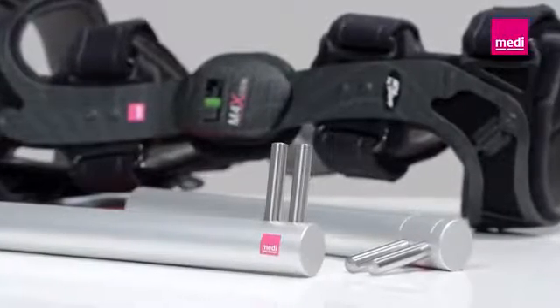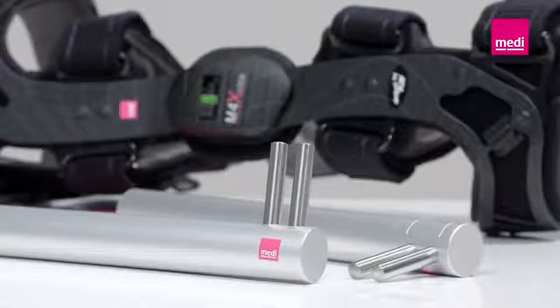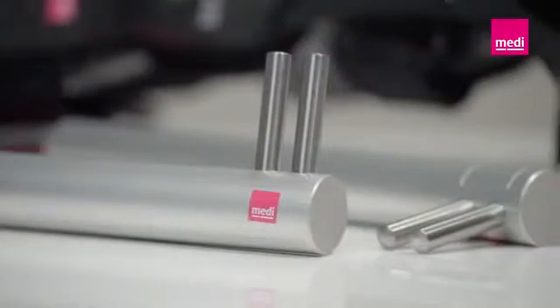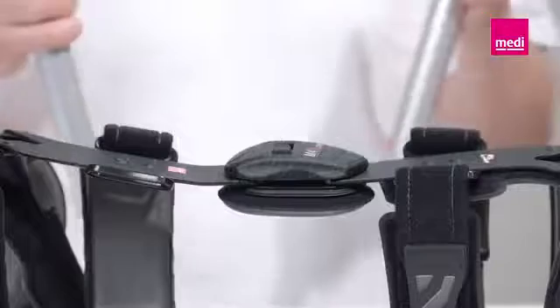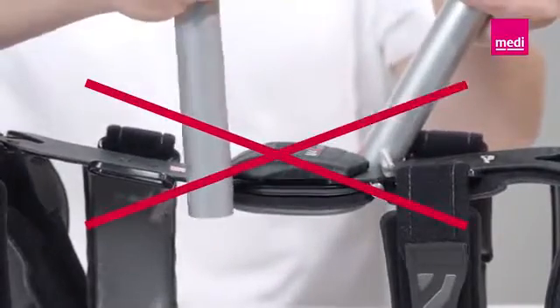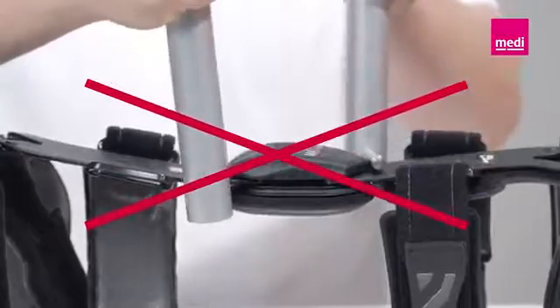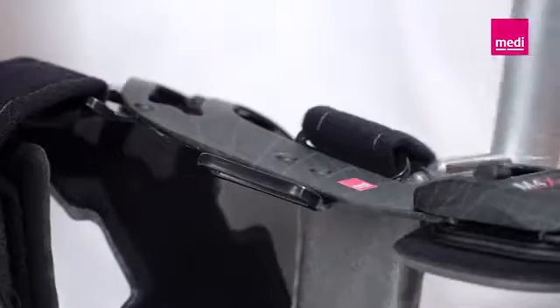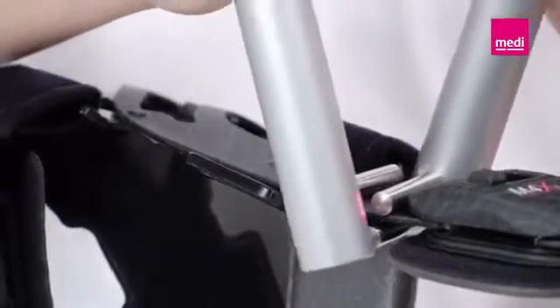The Medi bending tool can be used to help mold the orthosis closely to the patient to guarantee the best possible fit. This prevents painful pressure areas and guarantees the best comfort in wear. Please note the following points when adjusting the orthosis. Avoid damaging the hinges at all costs. The hinges should never get between the two bending tools. Always isolate the hinge from damaging forces by placing the counterpart in front of the hinge.